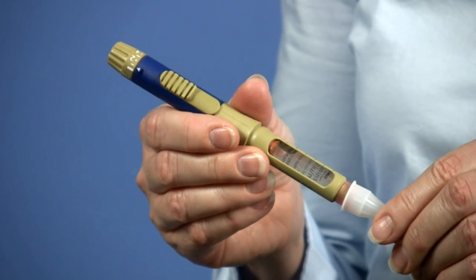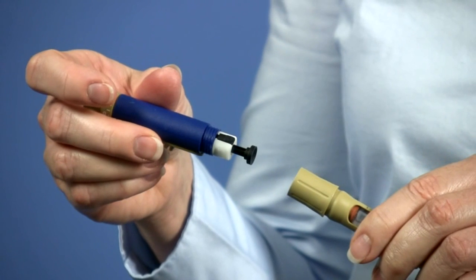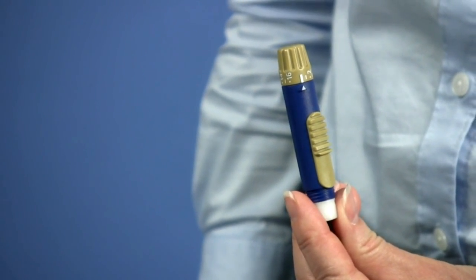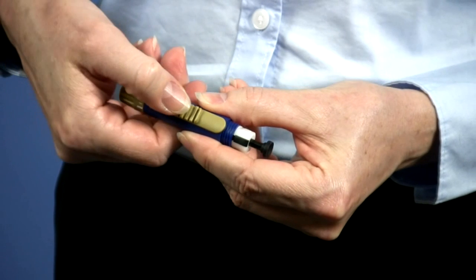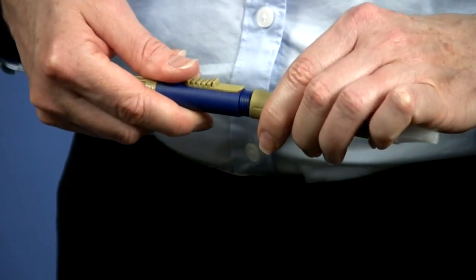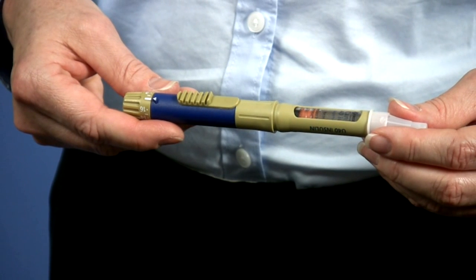To solve this problem, place the outer protective cap back onto the needle. Unscrew the cartridge holder. Slide the release button towards the internal plunger and hold in place until the starting line on the dose selector returns to the arrow on the body. Next, dial 2 units on the dose selector without screwing the device back together. Push and hold down the release button towards the internal plunger until the starting line on the dose selector returns to the arrow. Without rewinding the internal plunger, screw the cartridge holder and the VetPen body back together gently but firmly. This will release the cartridge plunger and expel some of the insulin. You now need to prime VetPen to prepare it for use.